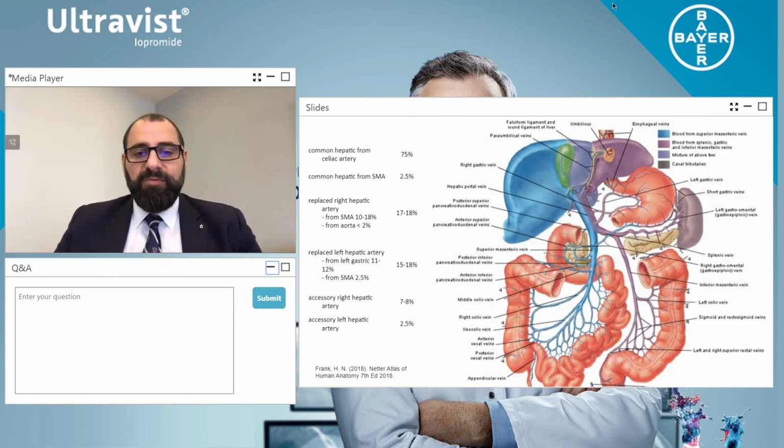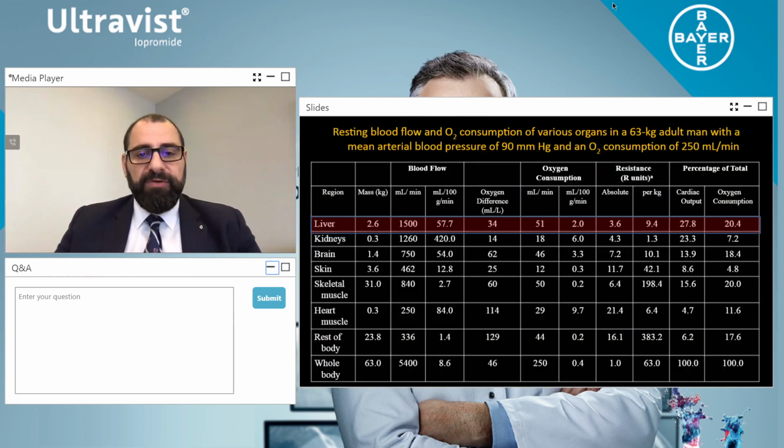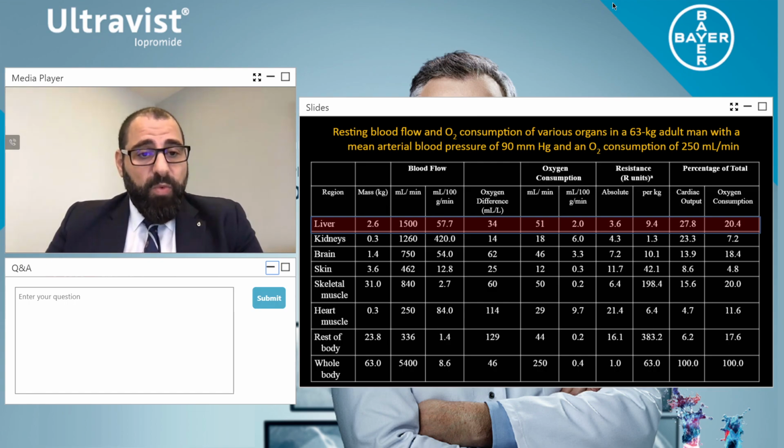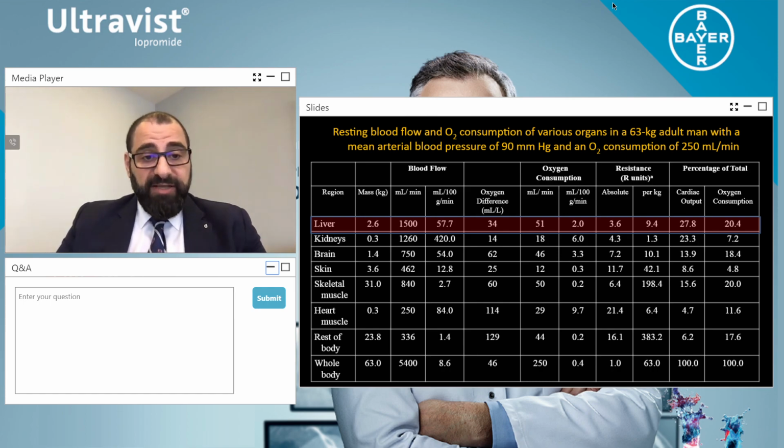amount of blood which is leaving the cardiac output that's going through the liver. Well, if you think about it, the liver is about 2.6 kilos, and it's pumping every minute 1.5 liters of blood. So this is a highly vascular structure, and there is high turnover of blood within there. So this is where it's important to get the contrast at the right place and at the right time.